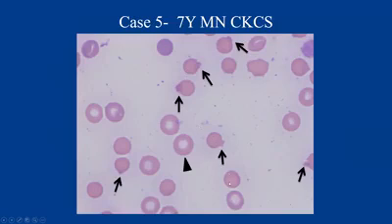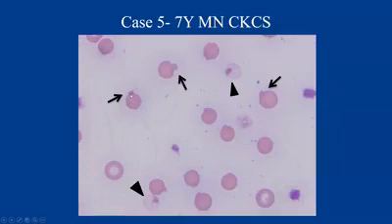We're seeing a bunch of these red cells that are smaller and lack central pallor, and I like to describe them as a little more orange in color than the typical red of our normal red blood cell. A lot of these cells also have irregular blebs coming off their margins, and they're sometimes a little lighter, sometimes the same color as the rest of the cytoplasm. But hopefully you can appreciate these knob-like projections coming off. Here are some more examples of them.